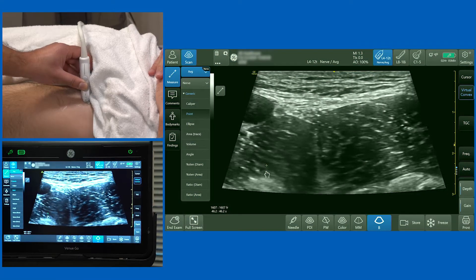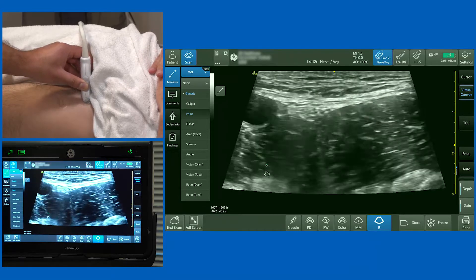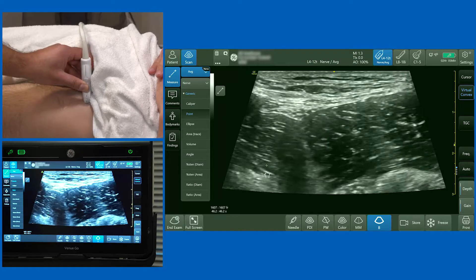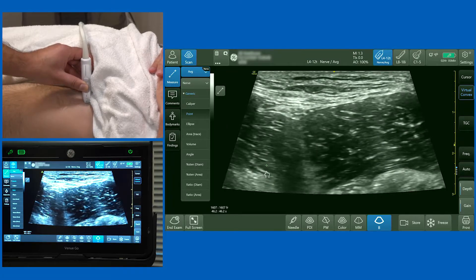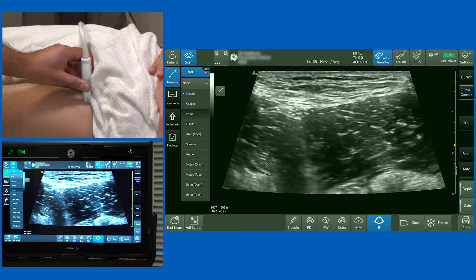Now we're going to be scanning the femoral nerve block, which is useful for hip analgesia and for knee analgesia — especially relevant for patients with fracture neck of femur or those having knee surgery where ambulation is not necessarily immediately postoperatively.